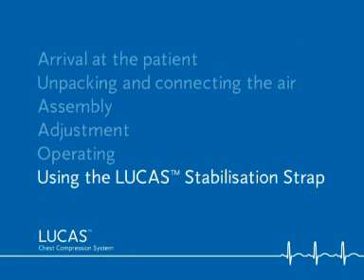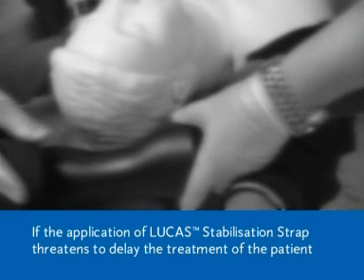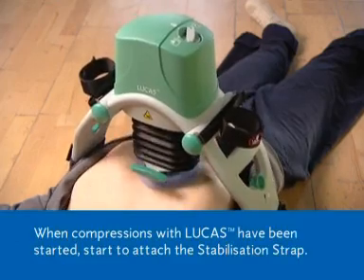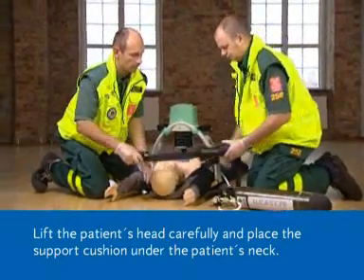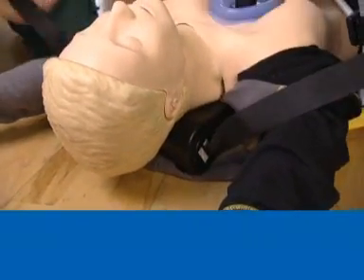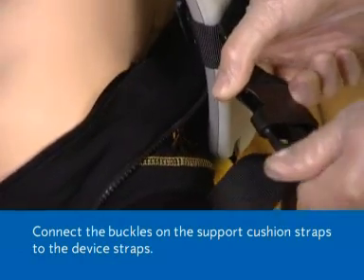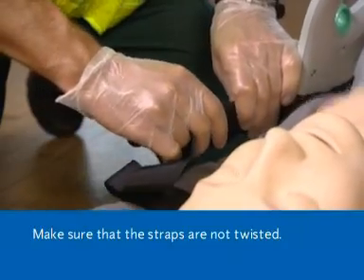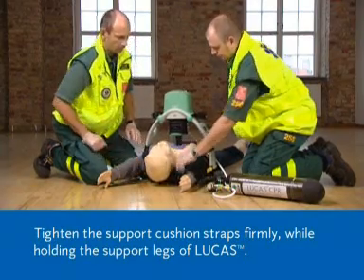Using the Lucas stabilisation strap. If the application of the Lucas stabilisation strap threatens to delay the treatment of the patient, it should be applied later or not at all. When compressions with Lucas have been started, begin to attach the stabilisation strap. Lift the patient's head carefully and place the support cushion under the patient's neck as close to the patient's shoulders as possible. Move the buckles on the device straps towards the patient's head. Connect the buckles on the support cushion straps to the device straps. Make sure that the straps are not twisted. Tighten the support cushion straps firmly while holding the support legs of Lucas.